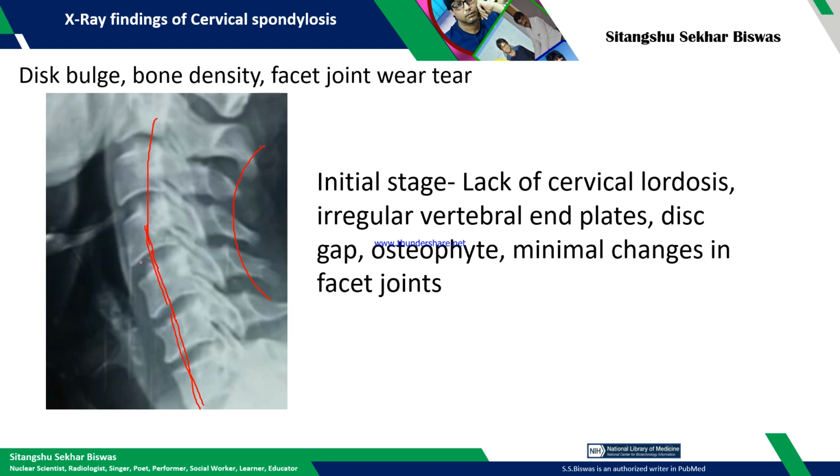Now I can see in this area there is an irregularity in the vertebral end plates, and the disc gap has also started to become irregular.